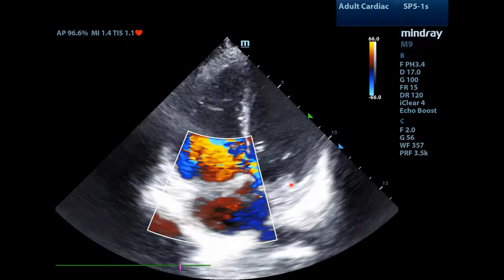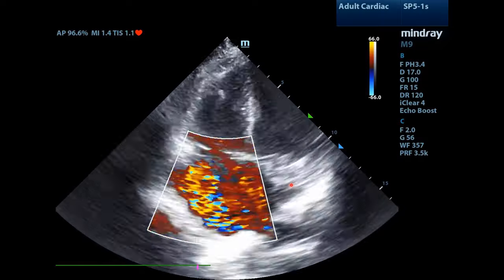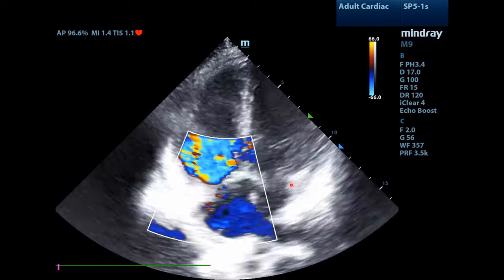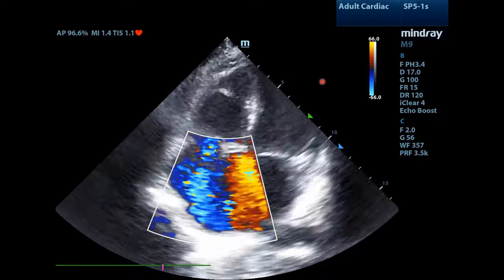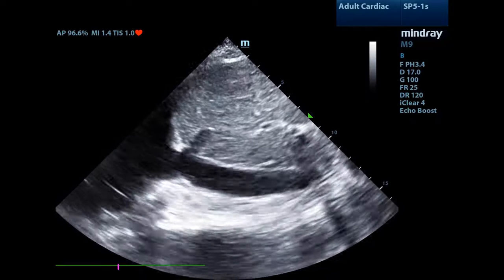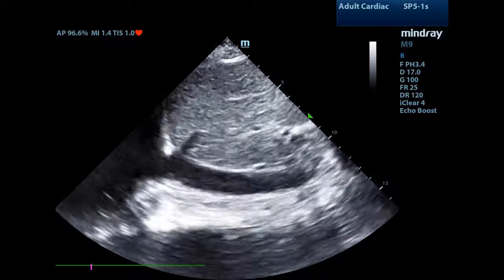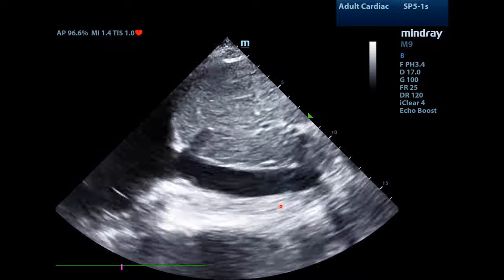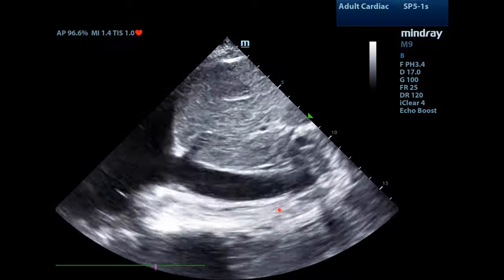We again place color flow Doppler over the tricuspid valve, and we see aliasing indicating high-velocity blood flow and a vena contracta that is so wide I cannot measure it. We finally move on to the IVC, and notice that it is plethoric and does not vary with respiration, as we expect from severe tricuspid regurgitation.